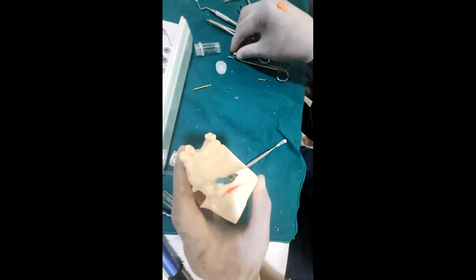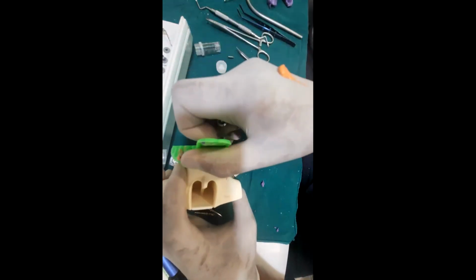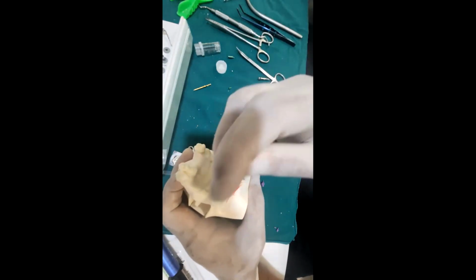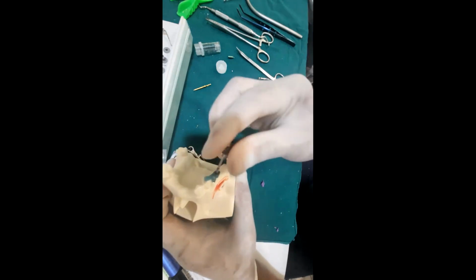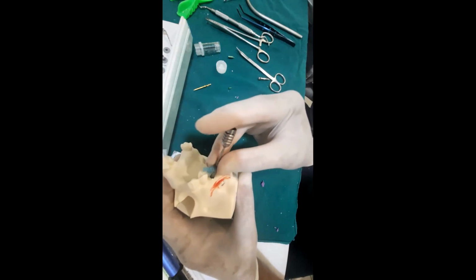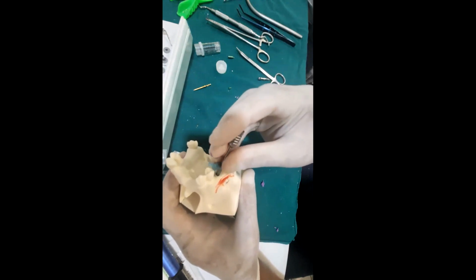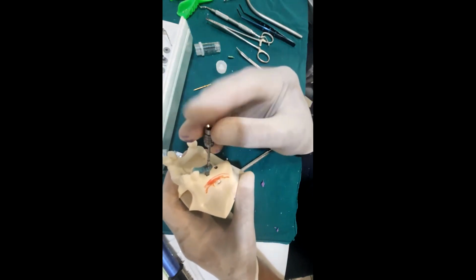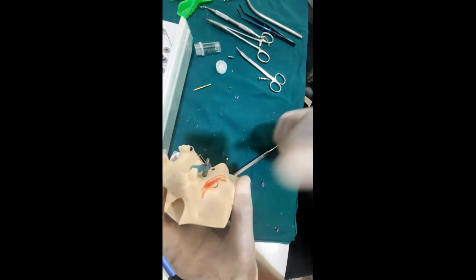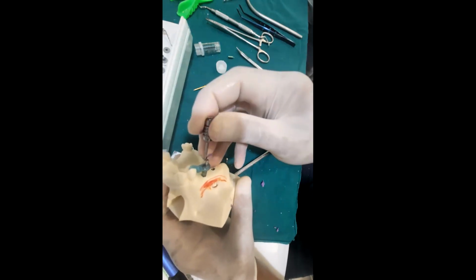So how this is helping now is when you have picked up the impression in your impression tray and you have transferred the lab analog to the lab, they have this spatial orientation. So whenever they check the master cast, your jig should sit in the same particular snap fit to ensure that your implant impression that you have given to him is accurate. So this is how it will be helpful.